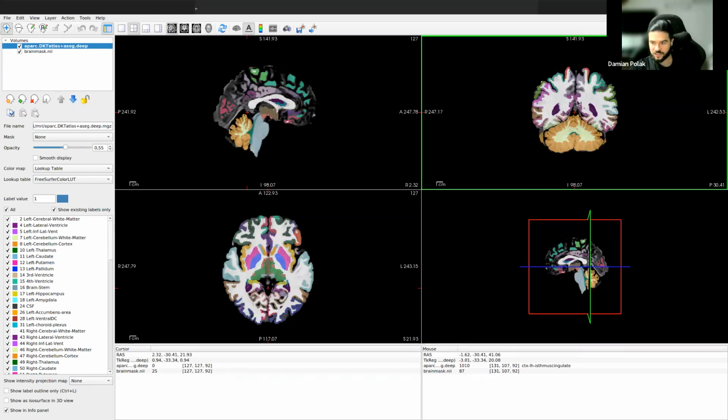Before segmentation, scans undergo a registration process to a normalized template. In the registration process, we ensure that every single voxel corresponds to, for example, 1 cubic millimeter of the brain. This allows us to calculate volumes of specific structures in the brain just by counting voxels belonging to a specific class. This way, the segmentation mask is transformed into a stats file, which we have seen before.